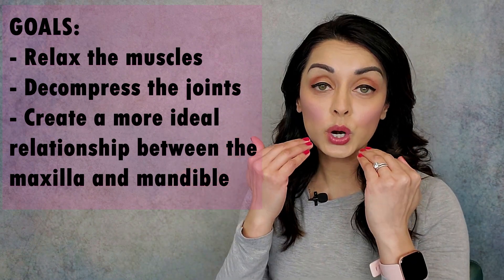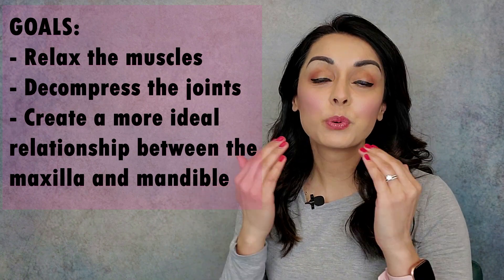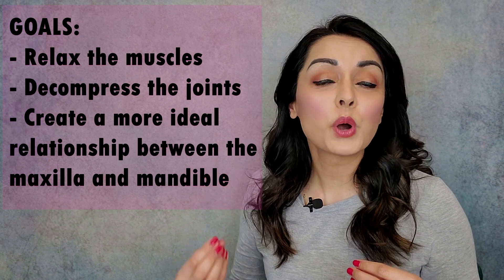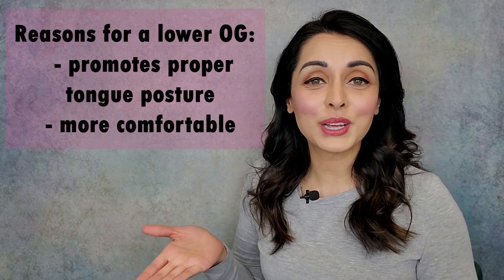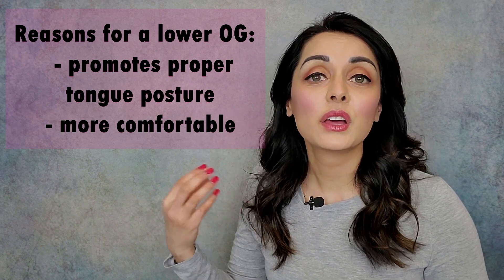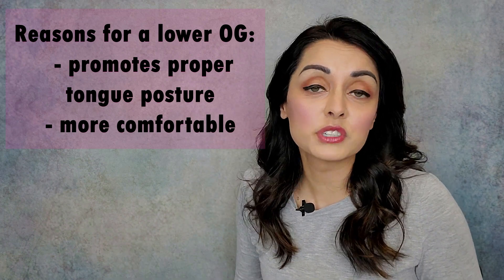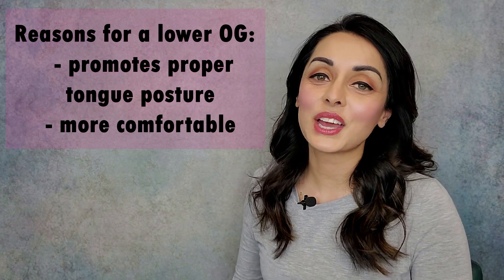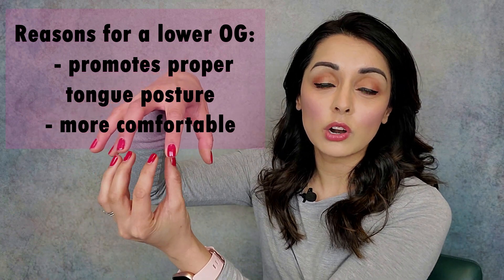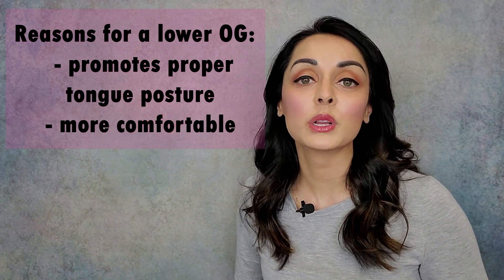These bite indexes will guide the upper teeth where to rest and will put the mandible in the position that we measured with the Aqualizer bite. When the mandible is in that position, it's a position where the muscles are relaxed and the joints are decompressed, and things get a chance to just rest and hopefully heal. The reason for a lower occlusal guard or orthotic or splint as opposed to an upper one is because it promotes proper tongue posture. The tongue should be up against the roof of the mouth with a light suction, and an upper guard can prevent this. Patients also tend to find lower guards more comfortable overall.